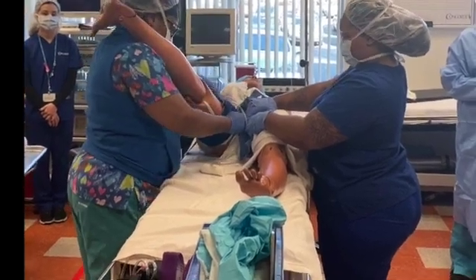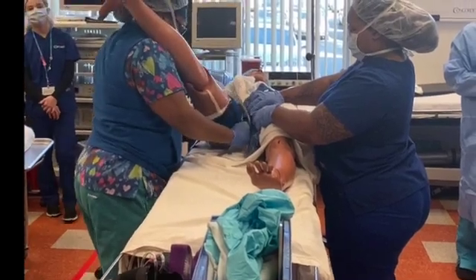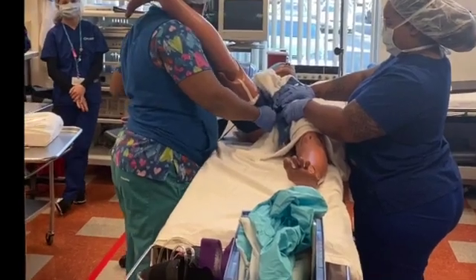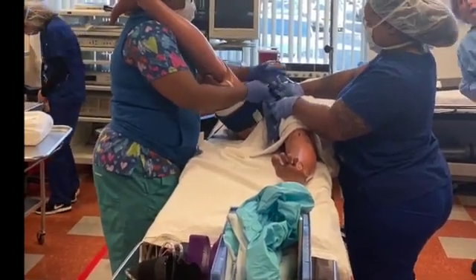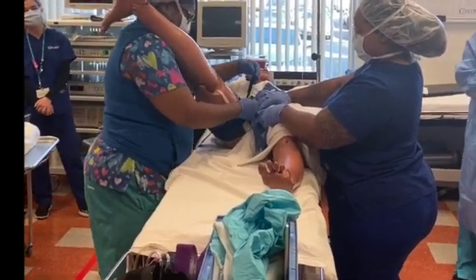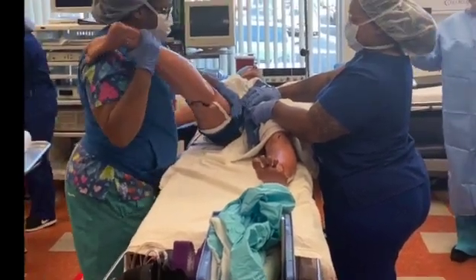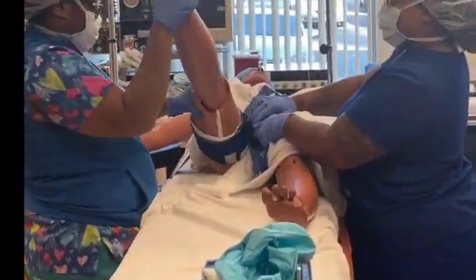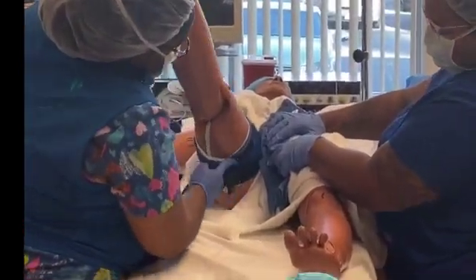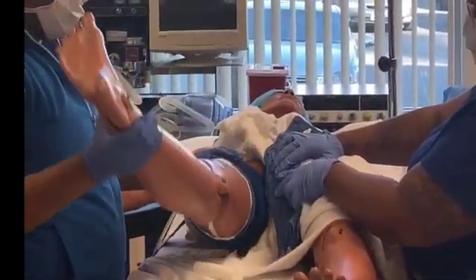you're pulling and making sure that you're down. And this is why you don't want to get it caught in their junk. It doesn't hurt you at all. You should see how the foot is on you. We got a back scratcher. Okay? And then I'm looking. Oh, the hip did move. So the other thing I'm looking at is making sure that there's no blue part on this person. So white, white, white. Everything's covered.